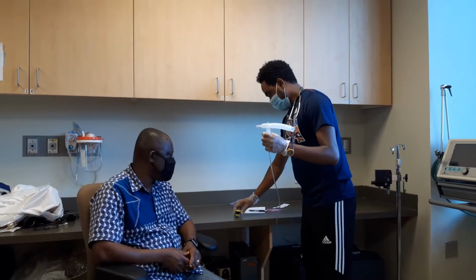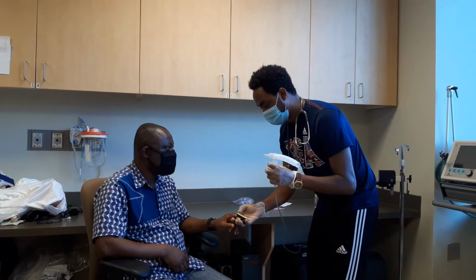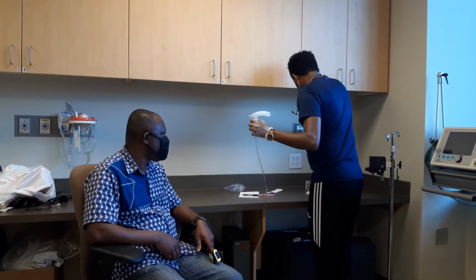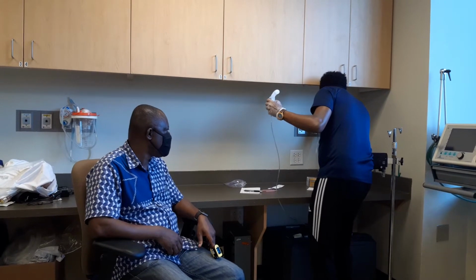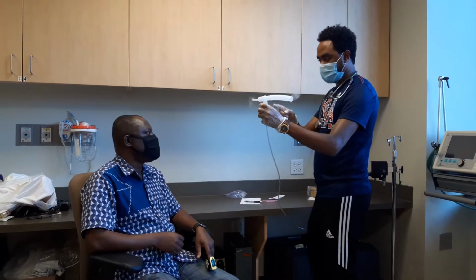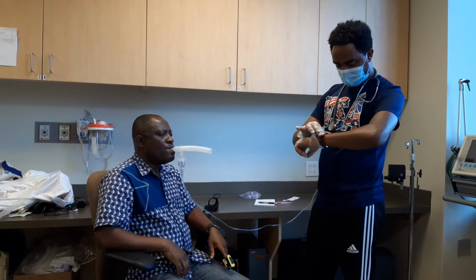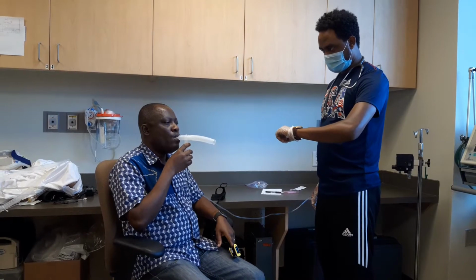I'm going to put on the pulse oximeter, because while I'm giving the medication, I'm going to assess your heart rate, okay? I'm going to set my flow meter to 8 liters per minute. Okay, see this medication, you can put in your mouth. I'll check after 5 minutes, and in between, keep deep breathing, okay?